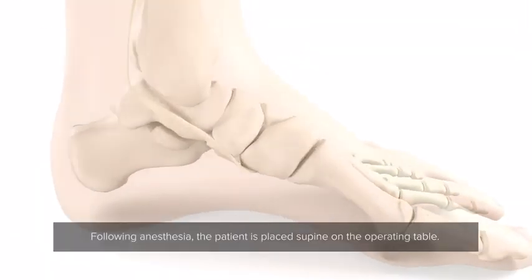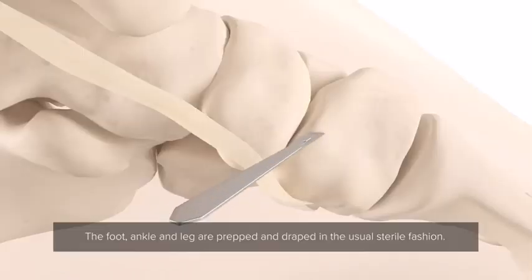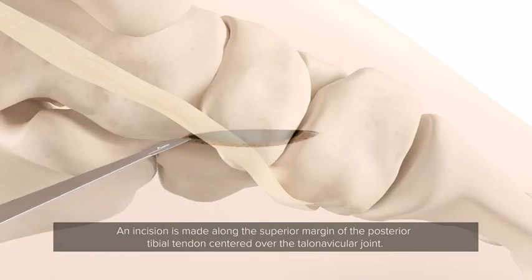Following anaesthesia, the patient is placed supine on the operating table. The foot, ankle and leg are prepped and draped in the usual sterile fashion. An incision is made along the superior margin of the posterior tibial tendon, centered over the talonavicular joint.